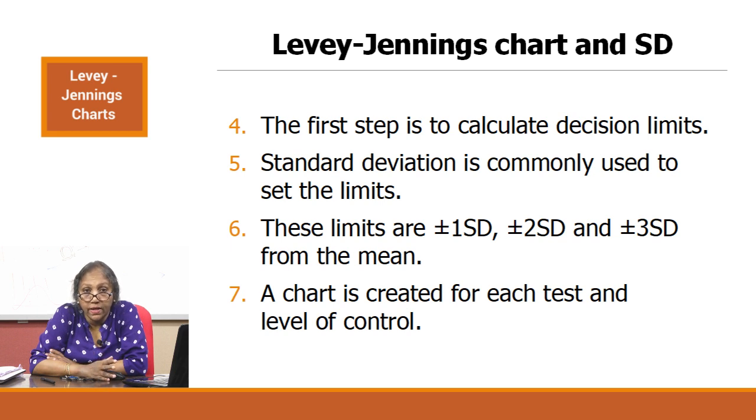That's one thing. And the second thing is that a lot of people, I have seen in my observation, since they don't really calculate the correct standard deviation, they just leave QCs unattended. And so if you don't set your standard deviations correctly, even if they are violating rules, it will not become immediately evident to you. We'll talk more about this when we are talking about setting a correct chart. And the chart, to continue with this discussion, has to be created for each test and for each level of control.